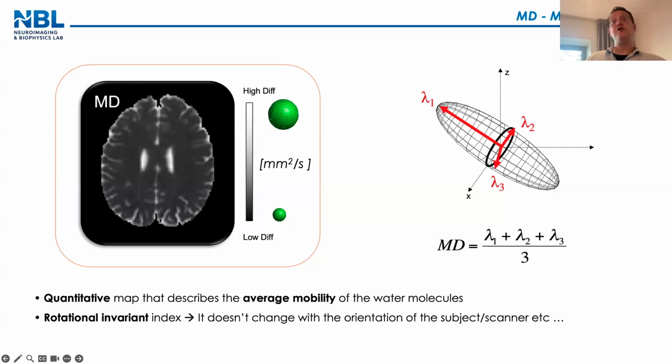To be fair, mean diffusivity from the tensor and the mean ADC should be theoretically the same. It's not for other reasons, other models, etc. But in principle, they represent the same thing, the average mobility in the voxel. So the mean ADC on 3 axes or the mean ADC on the tensor should be fairly close.